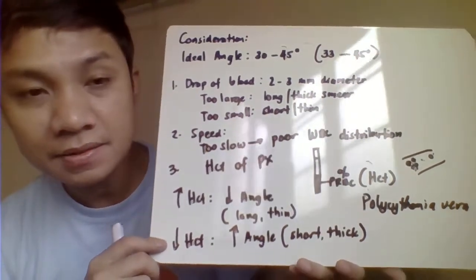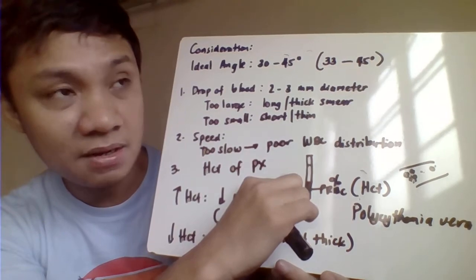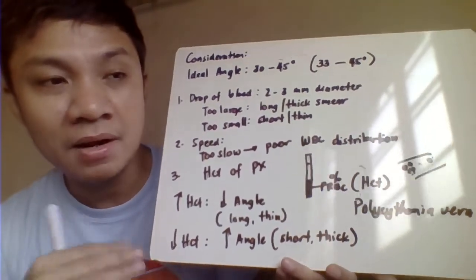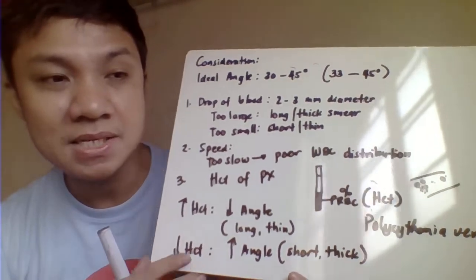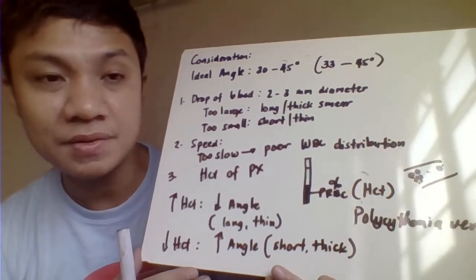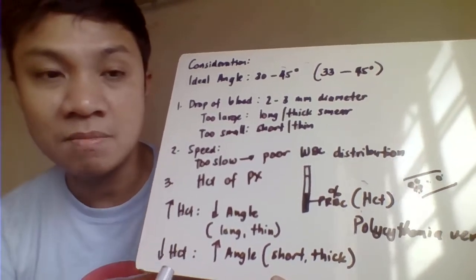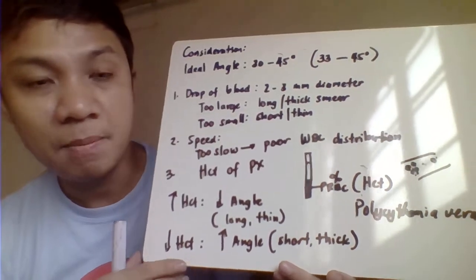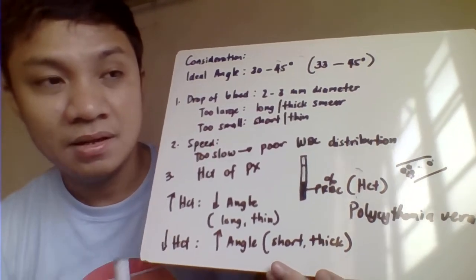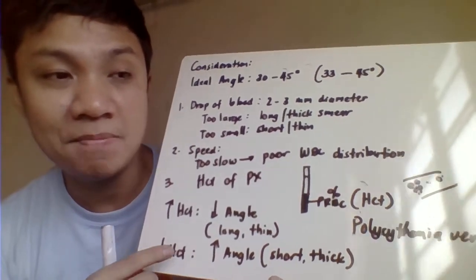On the other hand, decreased hematocrit. So, pag sinabing decreased hematocrit, konti lang PRBC, means say anemic ang patient. So, since sobrang malabnaw ang blood ni patient, all we need to do here as necessary adjustment with the angle of your smear is try to increase the angle of the film that would create here a blood film na medyo short and thick. So, medyo kakapalan natin ang film natin kasi sobrang labnaw ng blood ni patient.